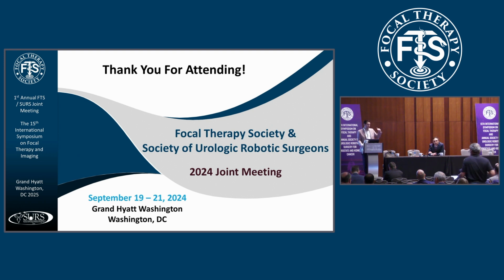As you go down, your resolution falls off. Yeah, so our temporal resolution at our site is about 5.5 seconds, and we kind of keep the same for post-ablation as well. So it's easier for everyone to follow if it's a kind of a single protocol. So one sequence at 5 seconds? So you should be scanning for a minimum of 2 minutes. That's what the PIRADS version 2.1 says, and we kind of continue to do that. Every 5 seconds? As long, I think, if it's less than 10 sequences, it should be good to differentiate.